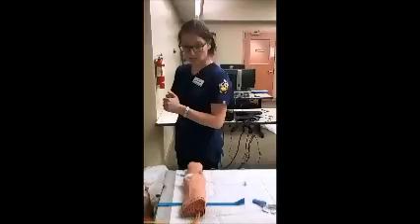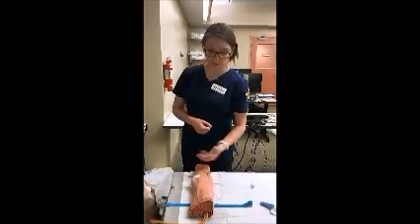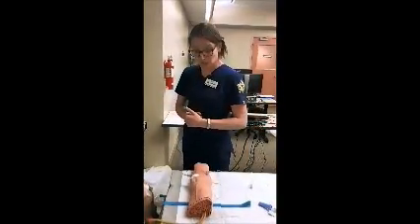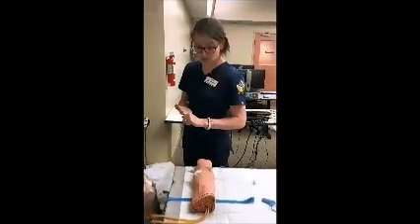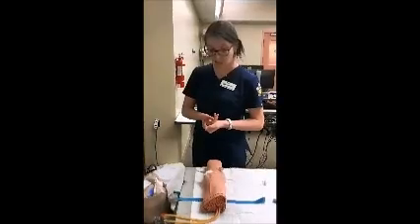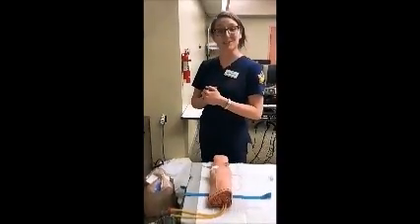Perfect. So I'll go ahead and document that we inserted an IV in the left peripheral, I would put something like about 2 inches below the AC area. We'll document that we started the IV infusion. We'll document what we started it with, the time, and how he tolerated the procedure. Also, what type of needle we did the procedure with. We used a 20 gauge IV catheter, so we'll do that. And we document all that, what time, how he did, and then we will leave Joe to his television watching.